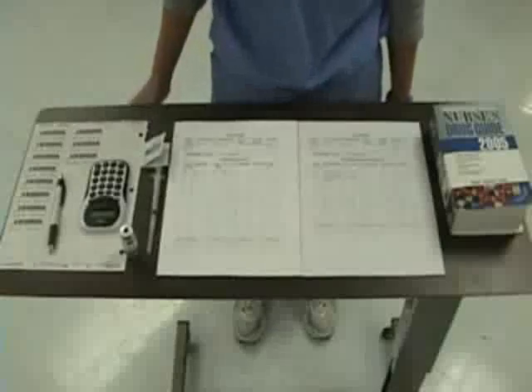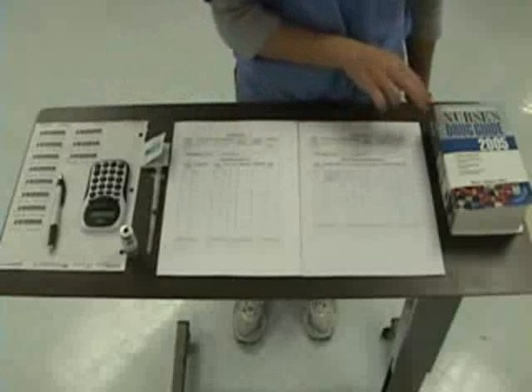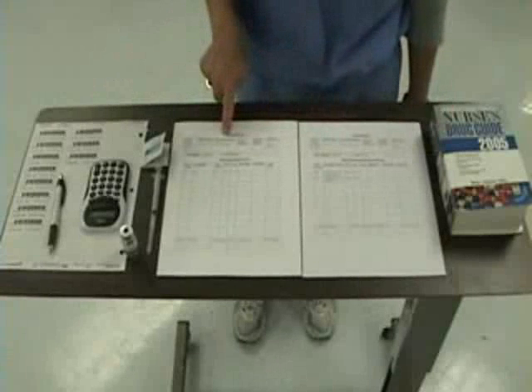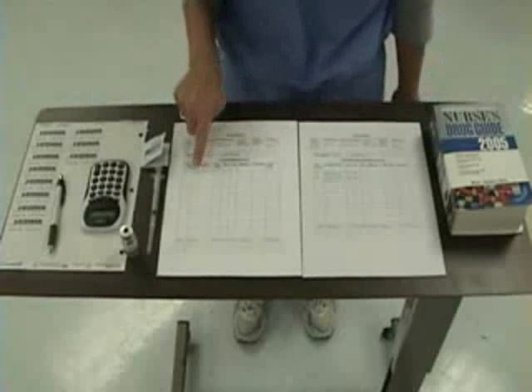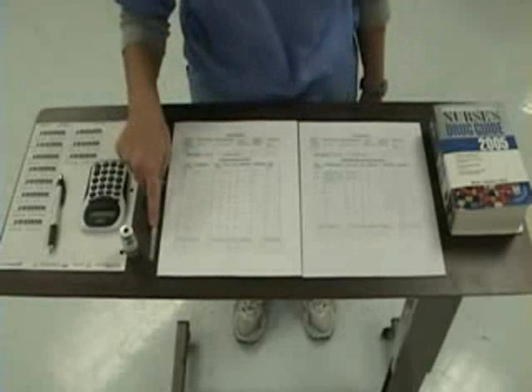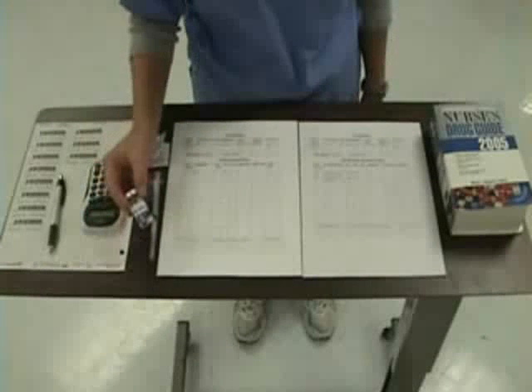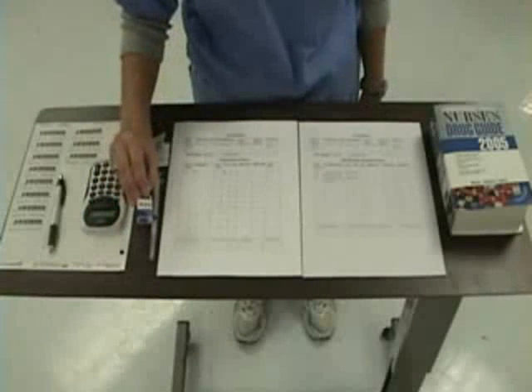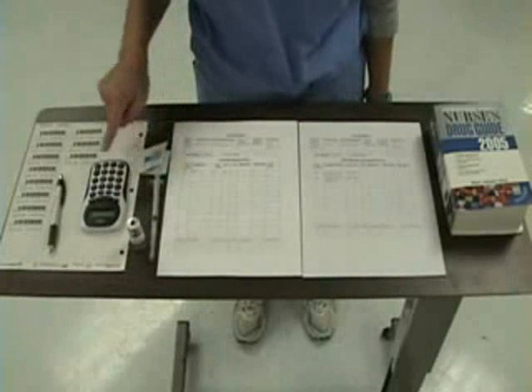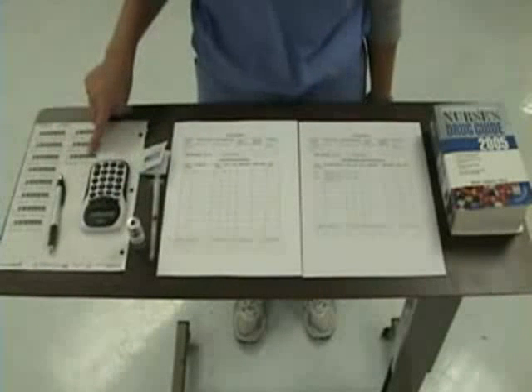I will begin by gathering my supplies. For this, I need a drug book, my medication record, or MAR, my continuous infusion record that has my IV fluids, a syringe with either a needle or a needleless device to draw from a vial. I need my medication, which is the Reglan, alcohol preps, a calculator, a pen, and patient labels.